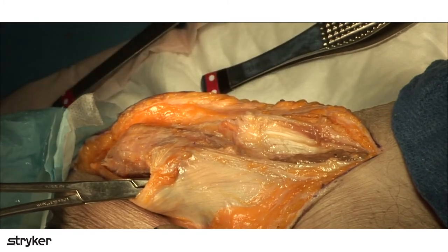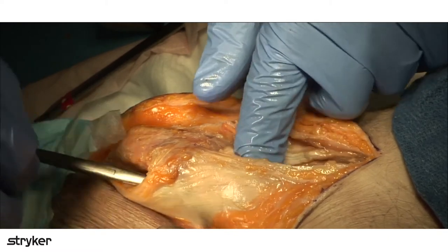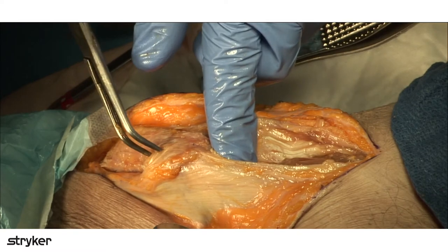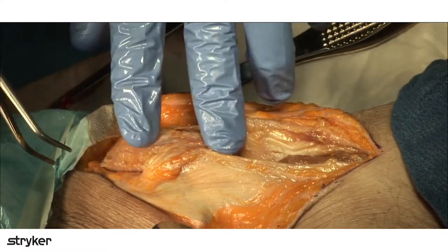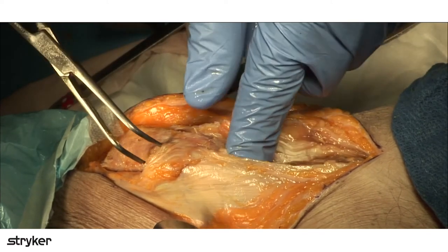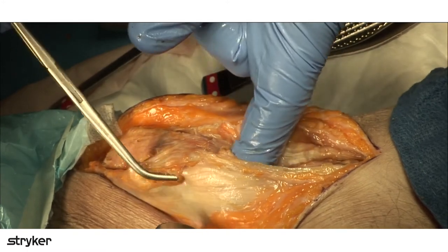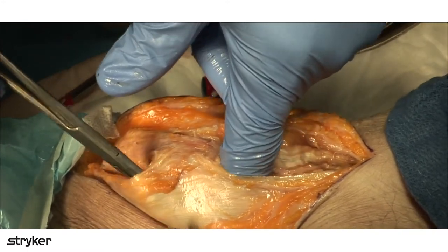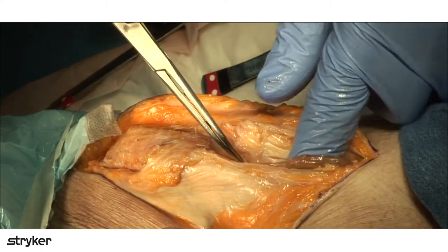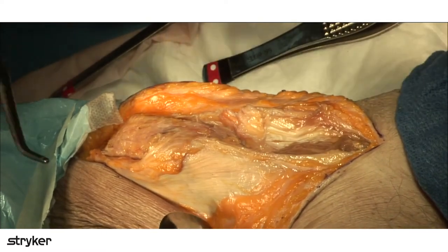Marcus, can you go over how much of the external oblique remains attached? It looks like about 3 centimeters, right, from pretty much here to here. You definitely want to keep that, essentially about 2 finger breadths, attached. There are 2 advantages: one, it takes all the tension off your abdominal fascia and abdominal contents because it all just goes with the bone, and it also protects your lateral femoral cutaneous nerve because it goes in there as well.